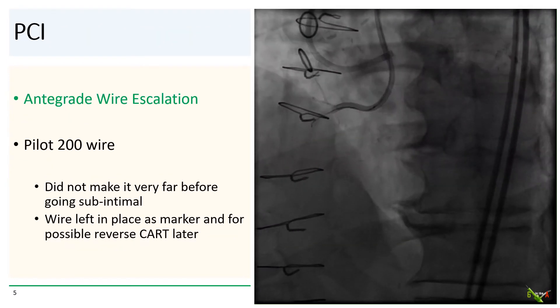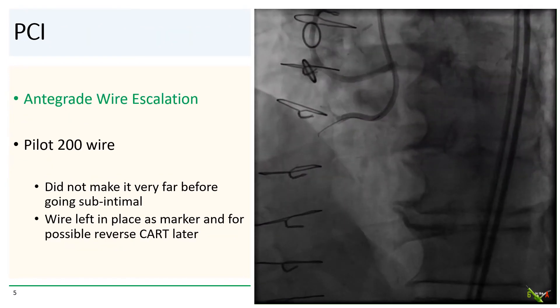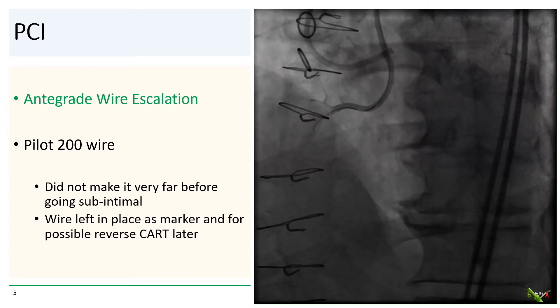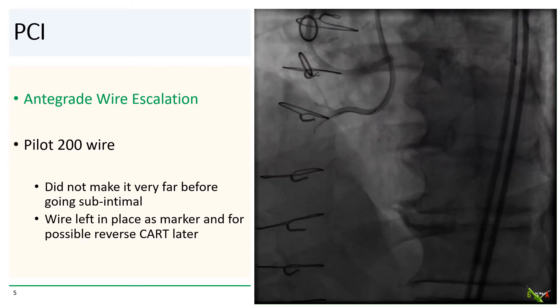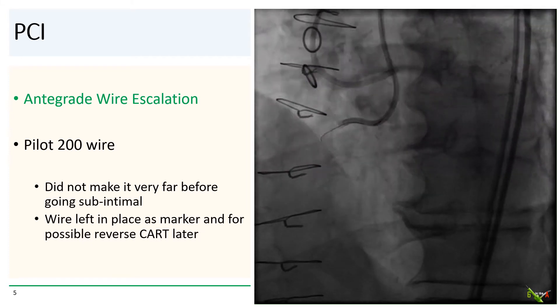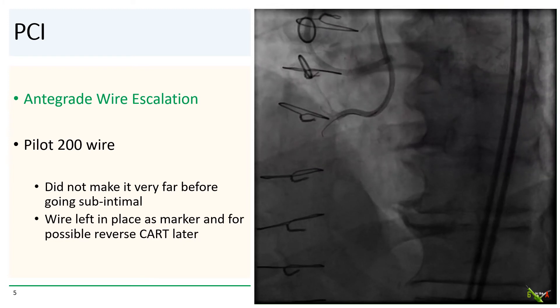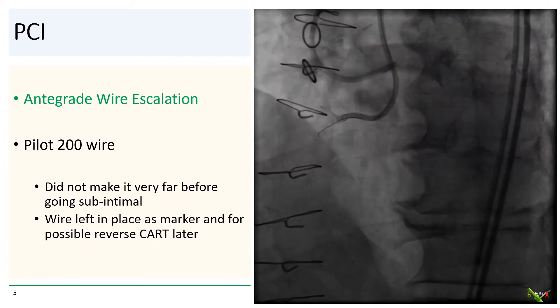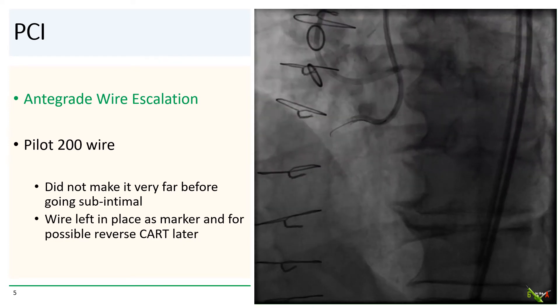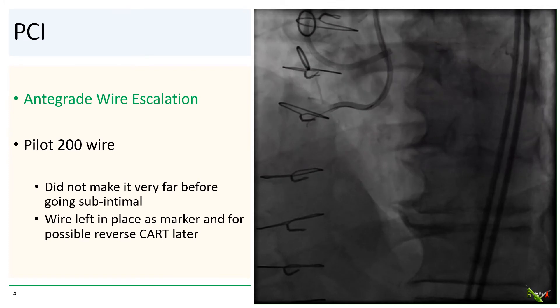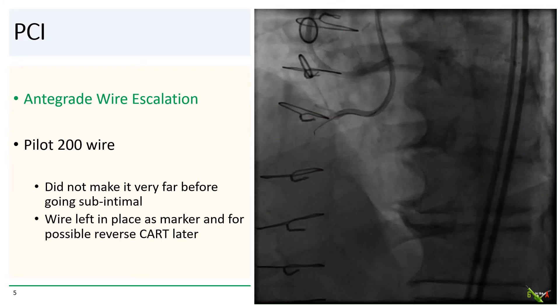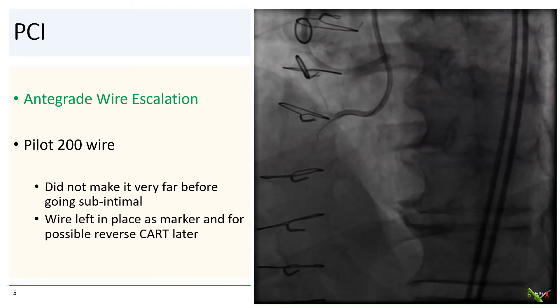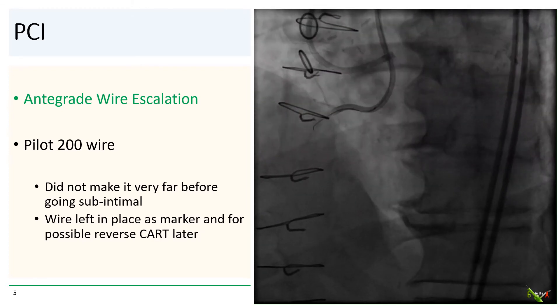So we got to work. We used dual eight French guides and started with a Pilot 200 wire via a Turnpike microcatheter. The Pilot 200 did not make it very far before dissecting the vessel and ending up in the subintimal space. This wasn't particularly surprising given the amount of disease in the RCA. We did leave the wire in place, both to be used as a marker for the retrograde wire and for possible reverse CART later on.